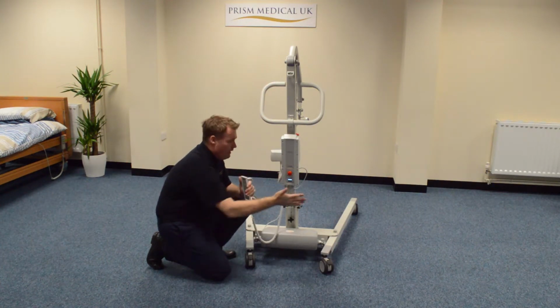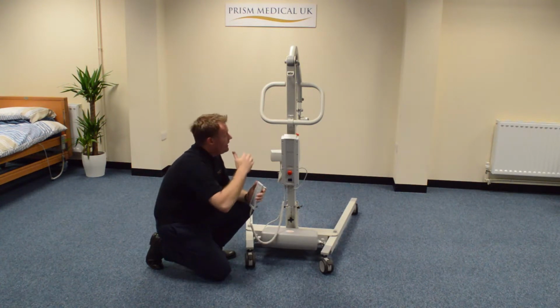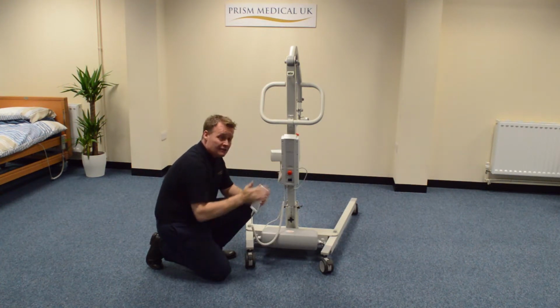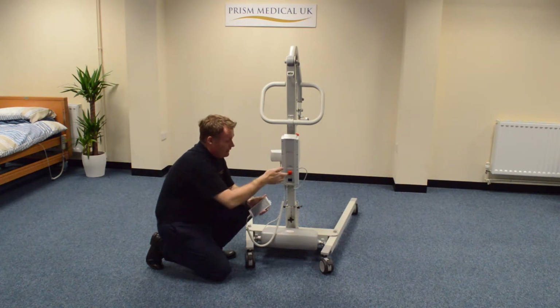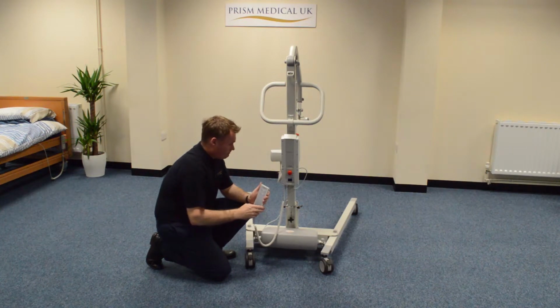Also on the control box we have an emergency stop button. The emergency stop button is there should there be an issue with the hoist at all. That will isolate all controls, and it can also be left in the off position if it's not going to be used for a long period of time.